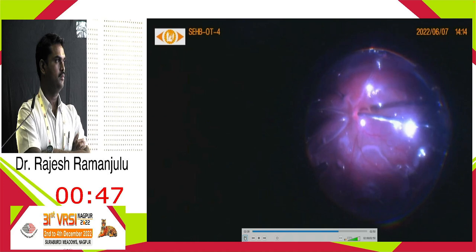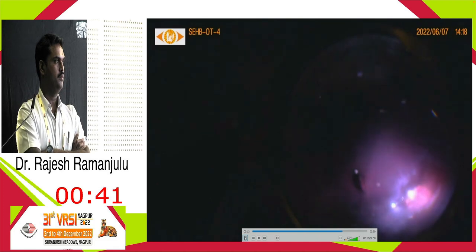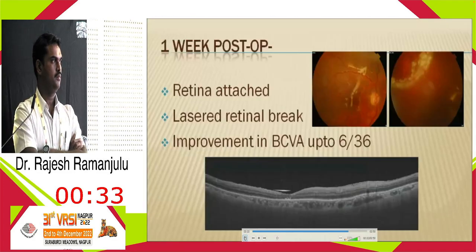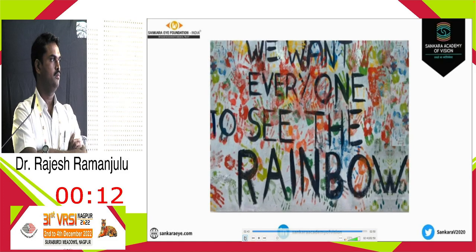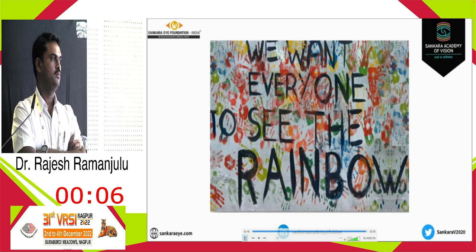Under air fluid exchange, after plugging a few small pieces, we could see that the IOP was building. There was immediate restoration of the vitreous cavity. Endolaser was done and silicone oil was placed. On the first postoperative day and 1 week later, the globe was well formed with maintained IOP. Oil was in situ in the vitreous cavity without any outflow, and the retina was well apposed. We can conclusively say that gelatin sponge can plug small to moderate inadvertent tears in the choroid and retina safely.